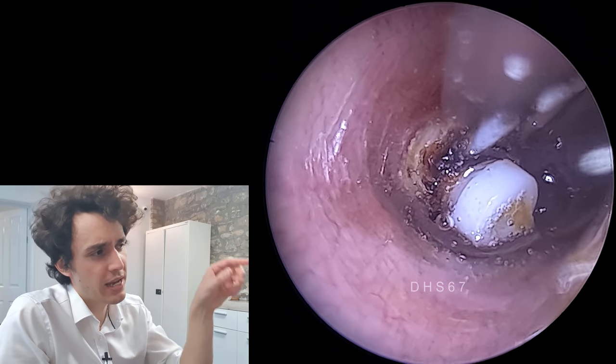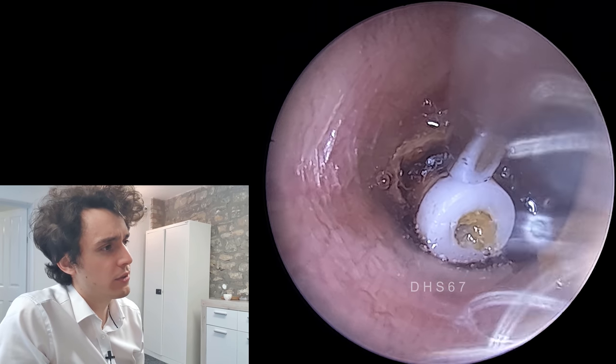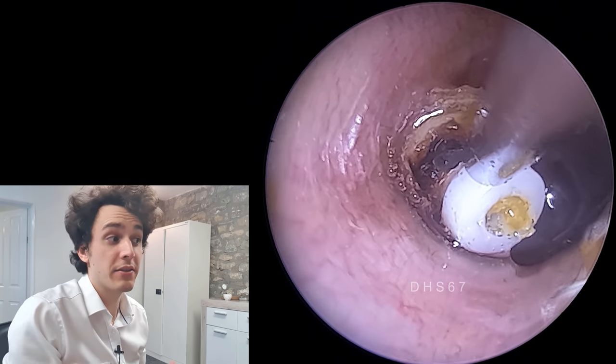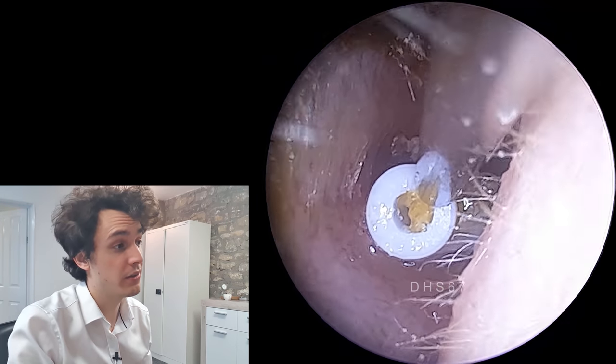Now you can see I'm just aiming for that dead skin which is crusted around the grommet, dragging it forwards. It's pretty much unadhered at this point, so I can very easily remove it now. It does get stuck again, unfortunately — that's just due to the baffle on the other side of the Shah grommet.